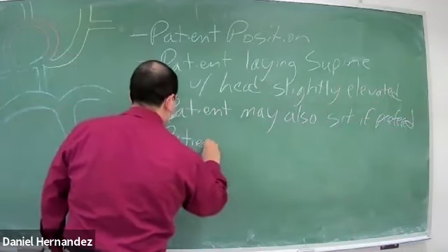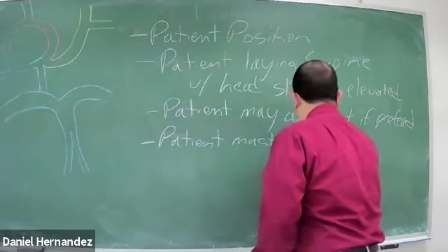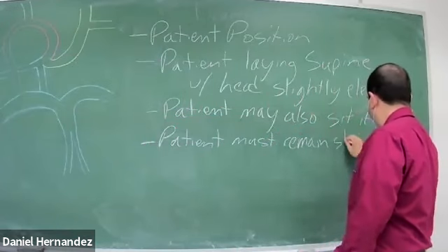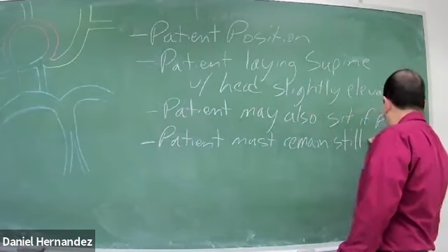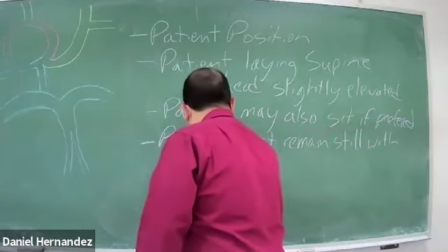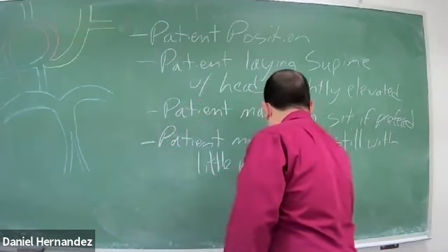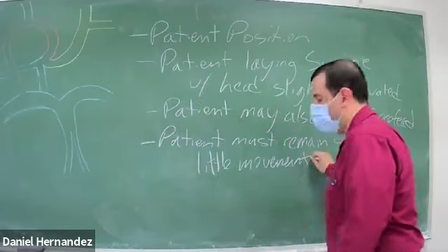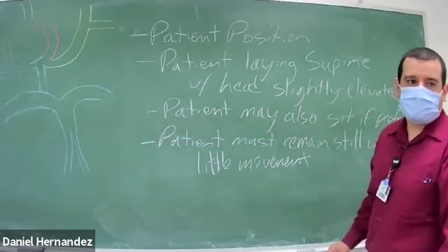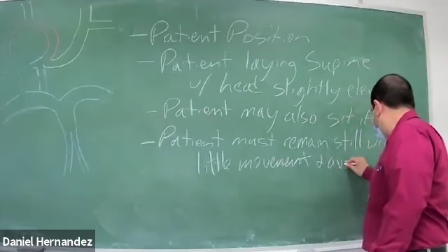The patient must remain still, with little movement, and avoid speaking.